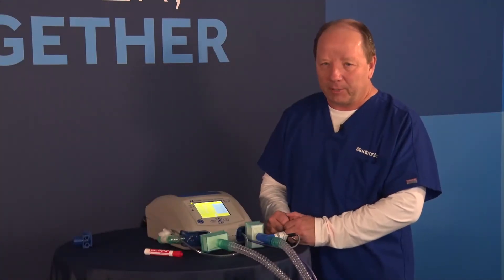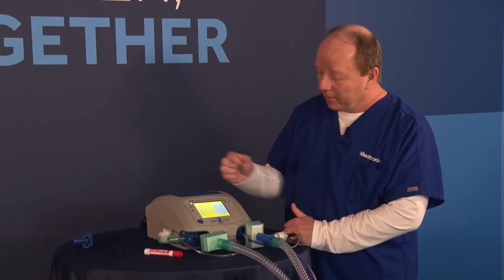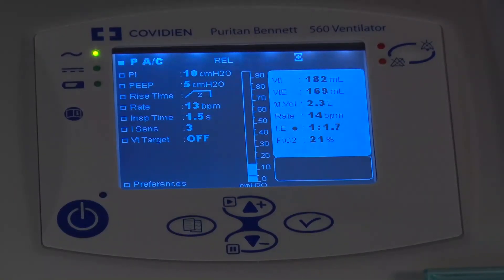One more thing about the display: you can tell when the patient is actually triggering. If I look at the I:E ratio area, just to the right of it, if I see a dot there, that means the patient is actually triggering. Here it is right there — that's what it looks like when a patient is triggering a breath.